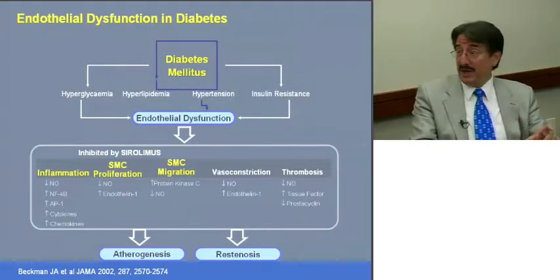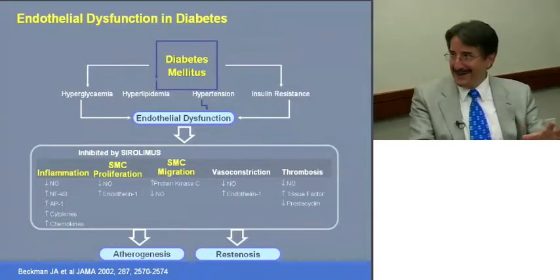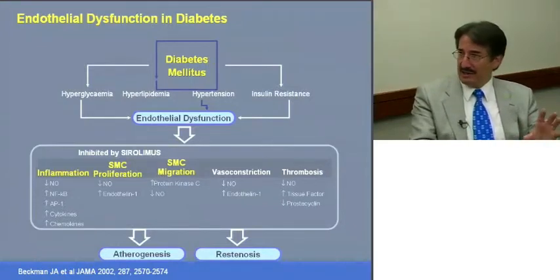And then once you manipulate a lesion, once we explode the lesion with a balloon and embed steel in the middle of it, how likely is the inflammatory response to generate restenosis? All of these features are clearly different in diabetics through a variety of redundant mechanisms. So it's not like there's one clear target that we could focus a single drug on. It's a very broad end organ influence of this underlying genetic metabolism.